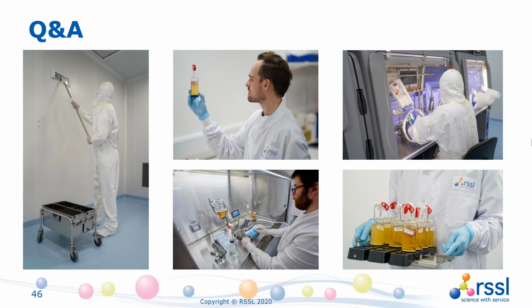And I've got a question from Charles, and he said, is there guidance for low fill volume products to pool prior to filtration to allow for an even split between canisters? Yes, that is a fairly standard method, and Pharmacopoeia does permit the pooling of small volume products.